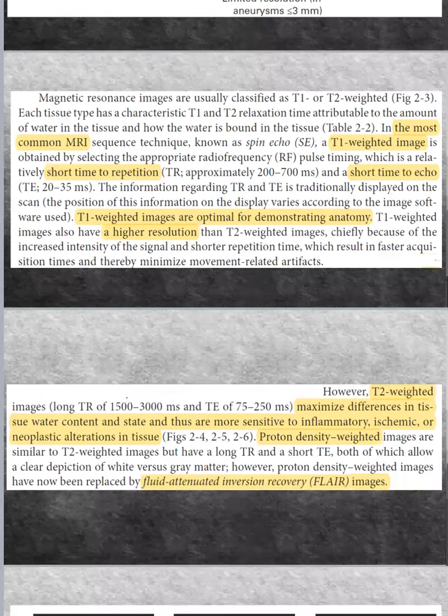So here I have T1 and T2. Do you know the difference between them? T1 and T2 weighted MRI.